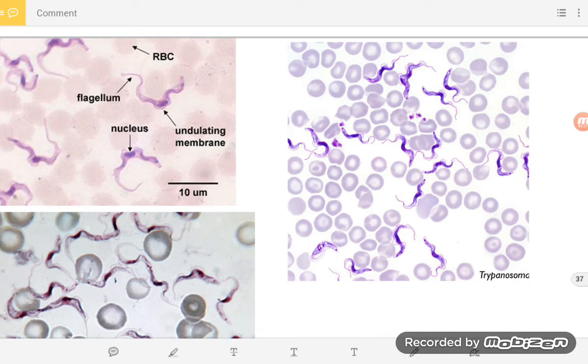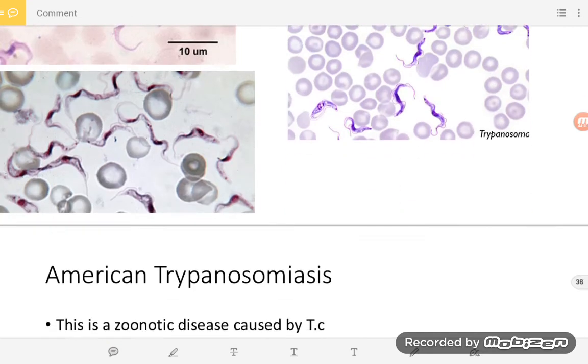They are present outside. So here the Trypanosoma brucei, we can see an S shape. Normally we can see an S shape. If they ask you to draw and label the infective stage or the diagnostic stage of Trypanosoma brucei, you should consider the morphology, the S shape, normally very large compared with a normal RBC. Actually this is two times the diameter of the red cell, right? Very large compared with cruzi, right?